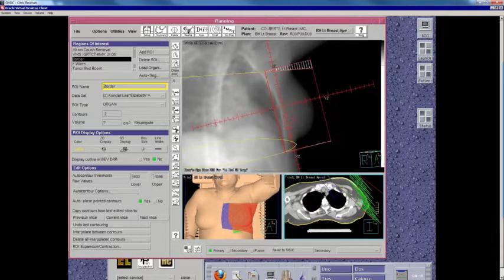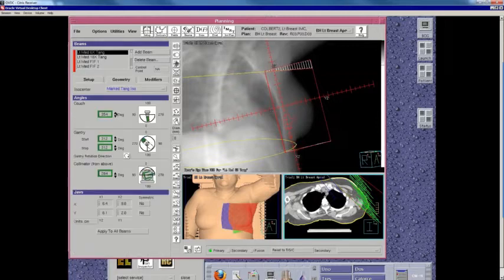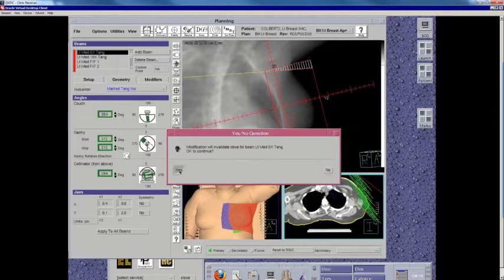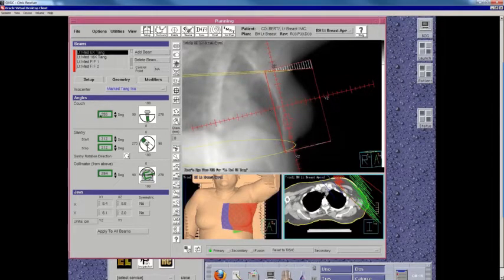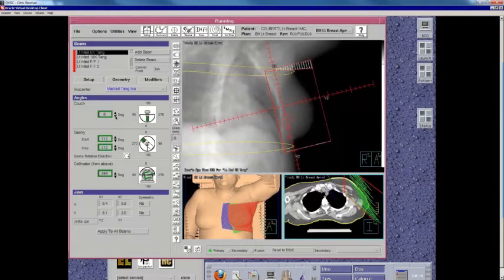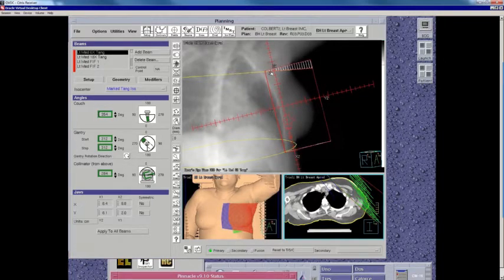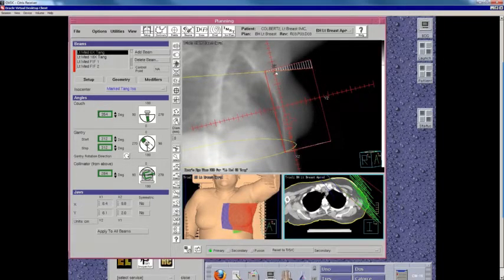And then when we design our tangent fields, what we do is we angle the couch until this ring becomes a straight line. And so I'm going to undo the dose here. So if we had a couch angle of 0, this is what it looks like. And so I typically set up my tangent beam to the right gantry angle, and then I just rotate the couch until I've made this ring a straight line. And that means that this ray, which is diverging at the top edge of my tangent fields, is diverging perfectly through this axial slice. So I've got the right couch kick to have a non-divergent cranial border.